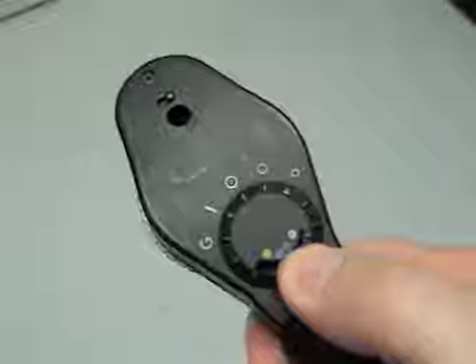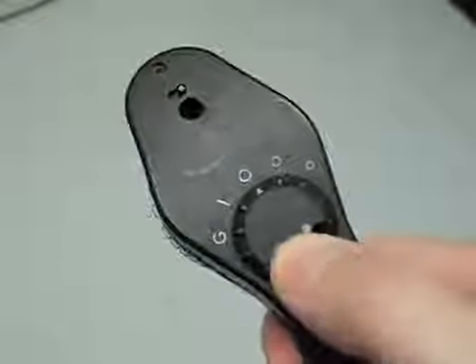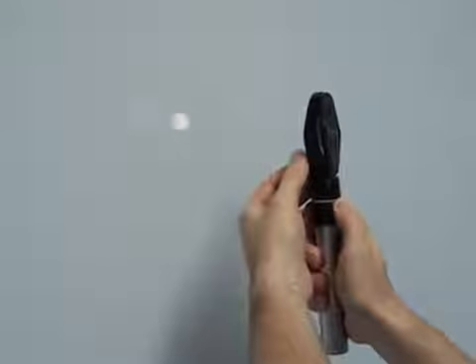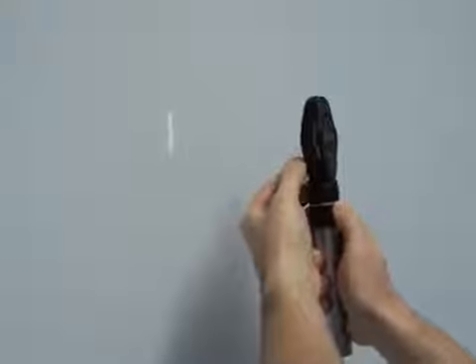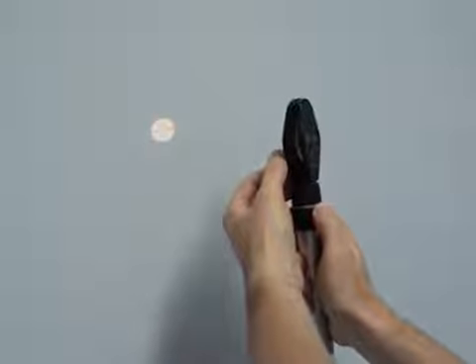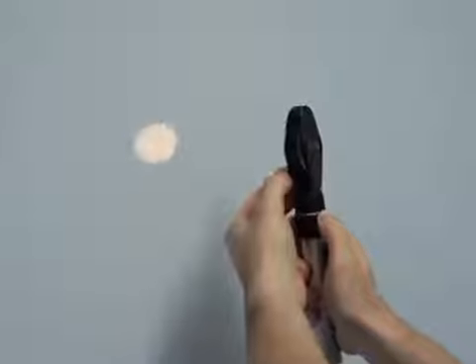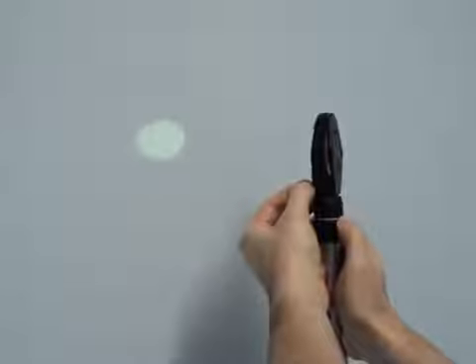The head contains a light source, lens bank, viewing aperture, and a series of filters. The filters can usually be selected using a dial on the front of the ophthalmoscope, such as the blue filter, which is used when examining the front of the eye with fluorescein dye. Similarly, the size of the aperture can be altered using the same controls. A smaller light may be more useful in a patient who has not had dilating drops instilled, or has a small pupil.